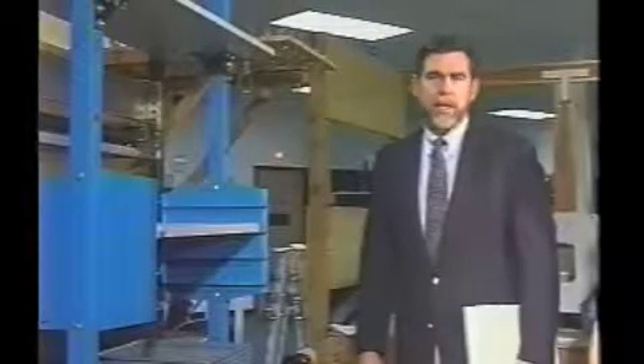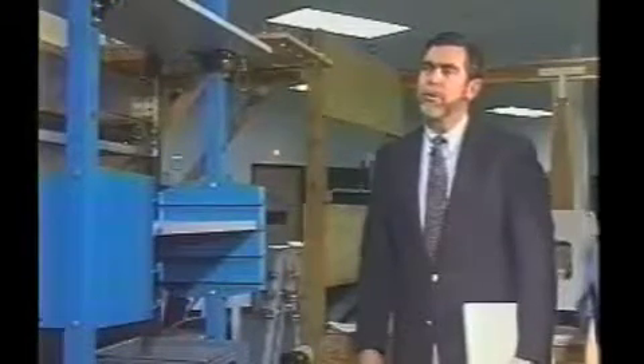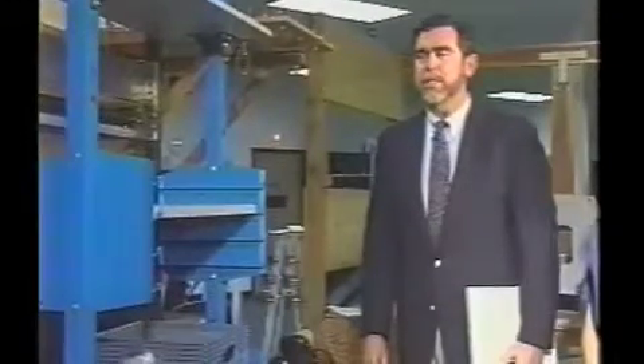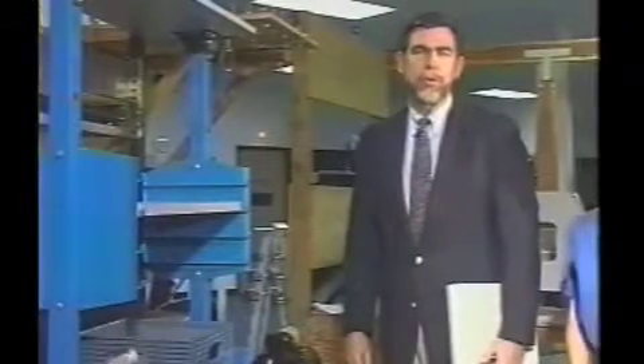This is the ninth test in the Cal FCP battery. It takes about 30 minutes or so, and we're only going to go through the first three of the subtests in the EPIC lift capacity battery. There are actually six subtests altogether. We'll just use the first three in order to evaluate Margaret's lift capacity.